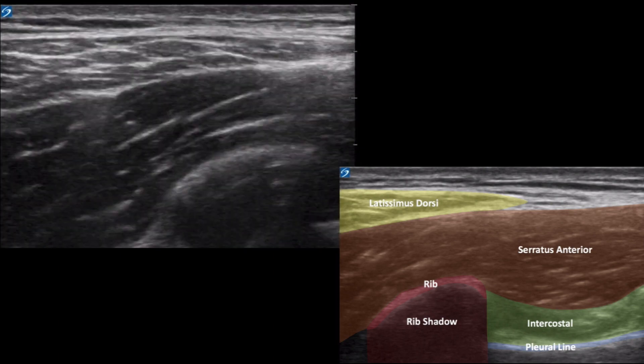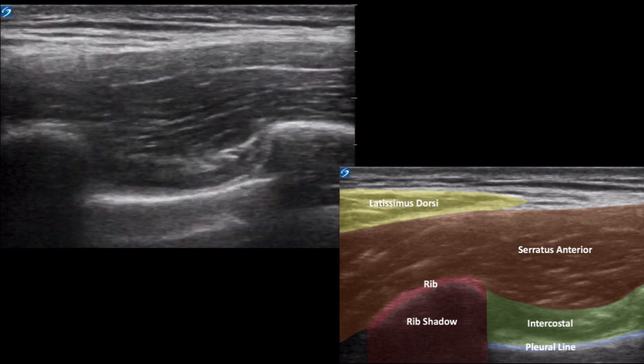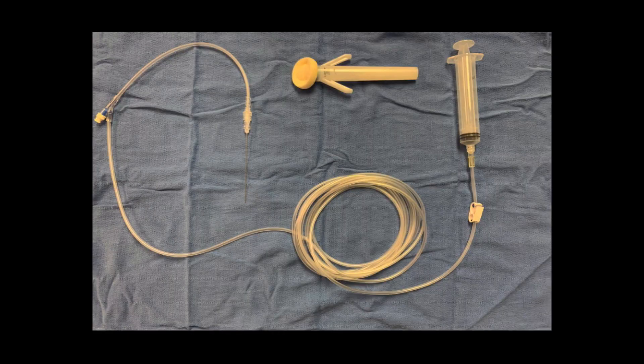Identification of the rib would be my suggested first step, as identification of the other structures subsequently becomes much easier. The serratus anterior block is known as a plane block. As the name suggests, it is targeting a fascial plane and the nerves that live in that plane. In this block, those nerves are the lateral cutaneous nerves. The plane block allows anesthesia to the entire chest wall that would not be possible otherwise.